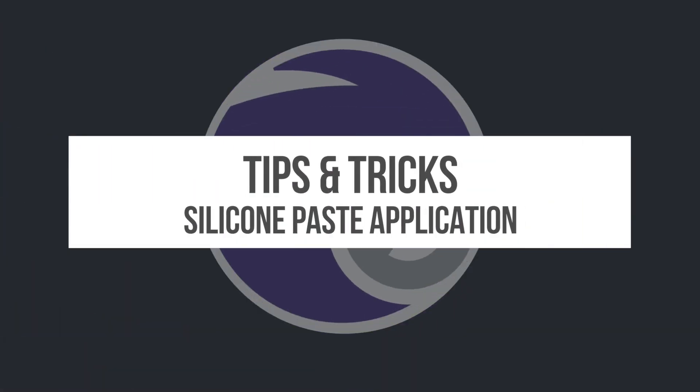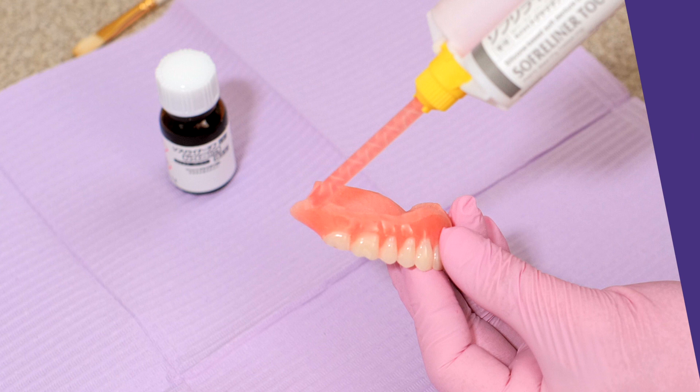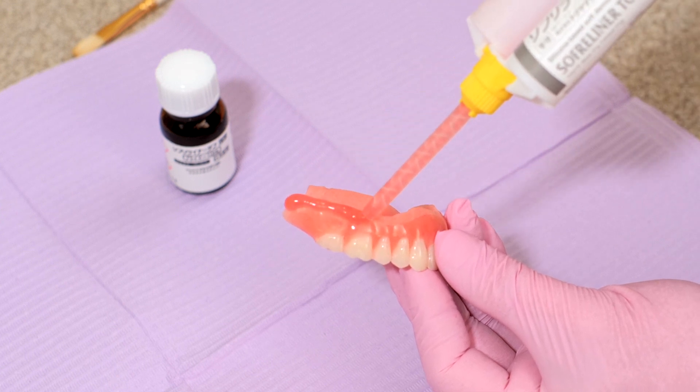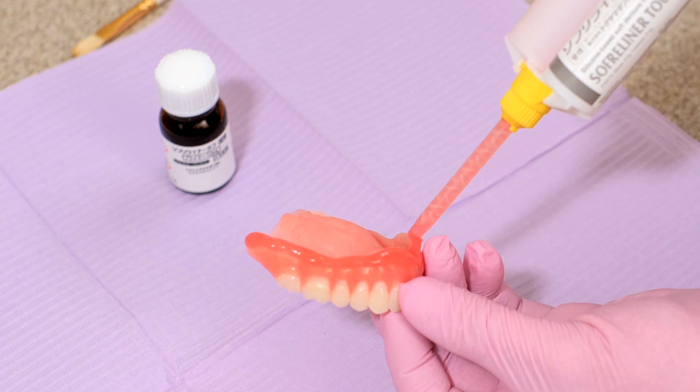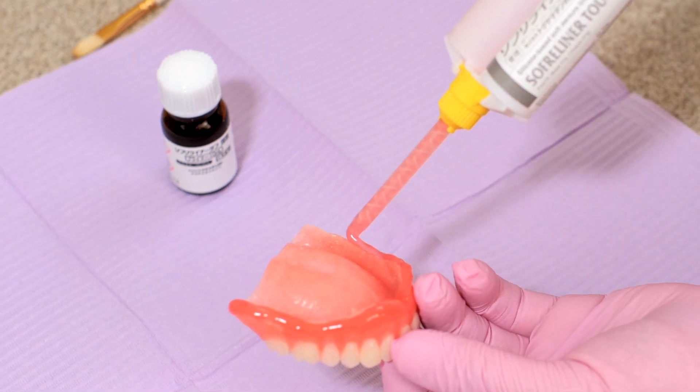Here's a tip and trick for silicone paste application. Here we're applying the Soft Reliner Tuff medium body to the upper denture. First we apply it to the borders and then we add enough material to cover the entire palate.